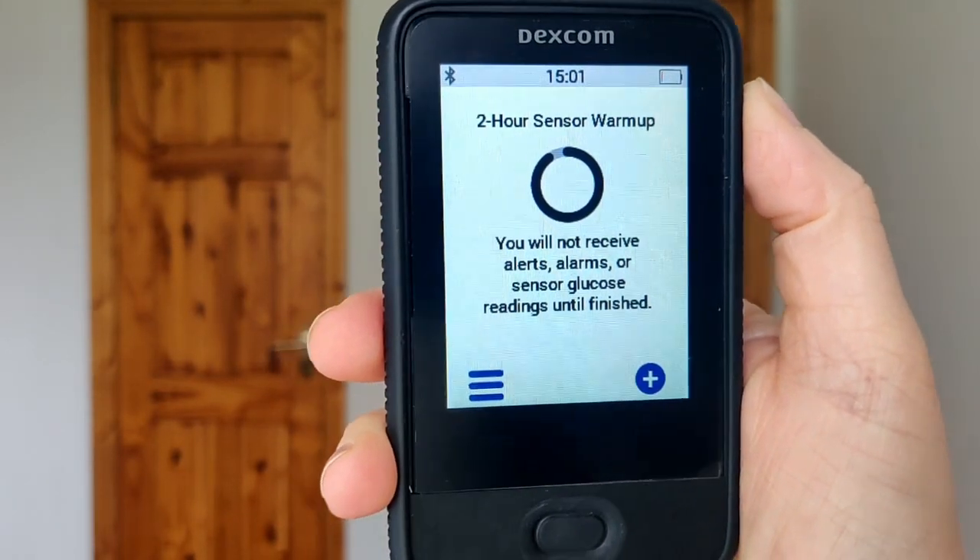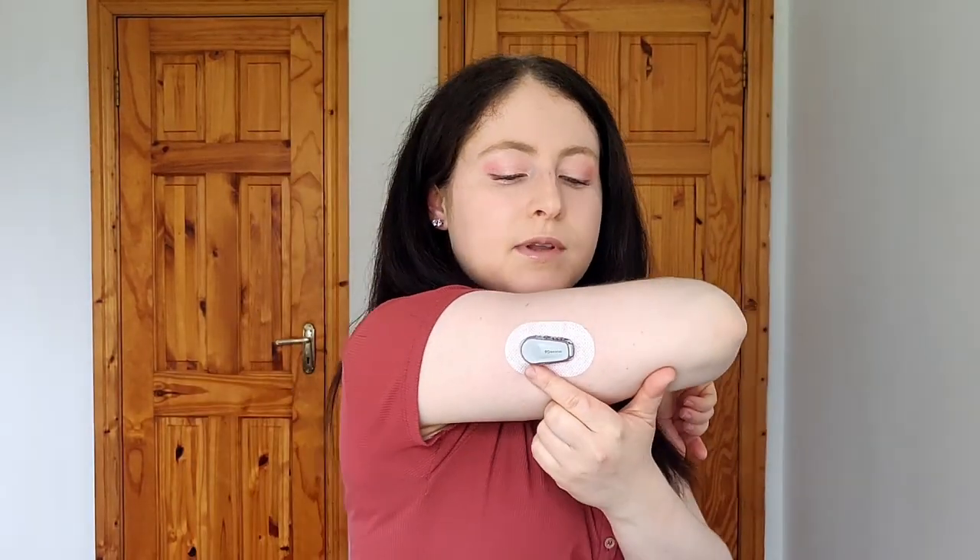It's starting up and now it's in the two-hour warm-up. It was very easy to put on a new transmitter — we just removed the old one, made sure we had the new code, entered it into the receiver or phone, put it on the sensor, and it paired and activated.